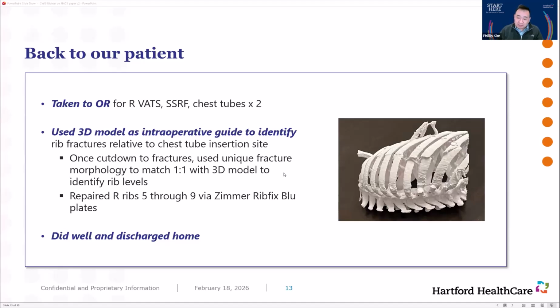But the plus side of that 30 minutes, about half of it is you're looking at the model and manipulating it and cleaning it. So you do, as a surgeon, I think, spend that time with the model so that you have some familiarity of how the fractures look as you're rotating it, cleaning it, spinning it. So I do think it's not all wasted time for those time spent cleaning the model and printing it. But obviously, if you can automate it and make it push, click, plug and play for you, then that will be awesome.